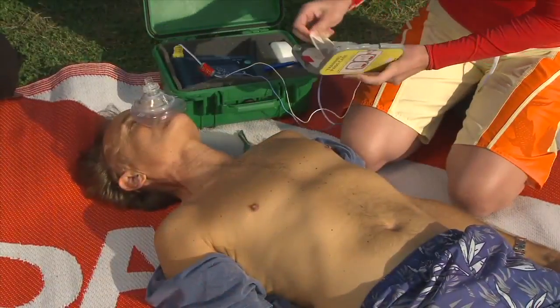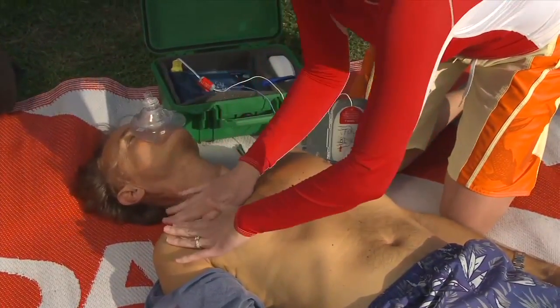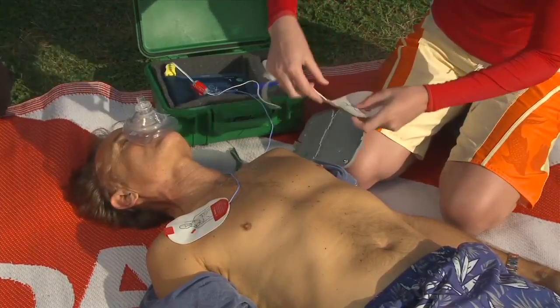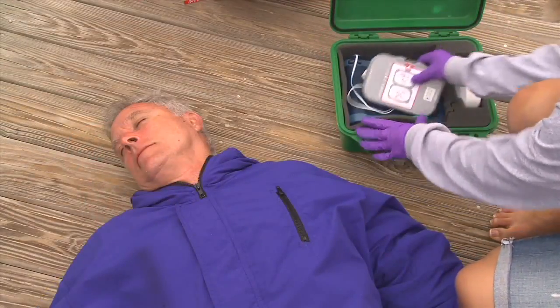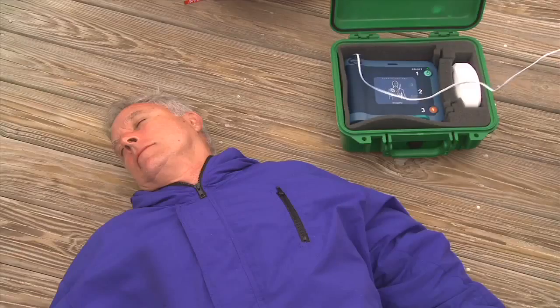Do not attach the AED unit to a person unless that person is unresponsive and breathing and circulation are absent. Place the unit near the patient's head on the patient's left side. Open it up and turn on the power. Once you turn on the power, the unit will begin a series of prompts directing you what to do next.